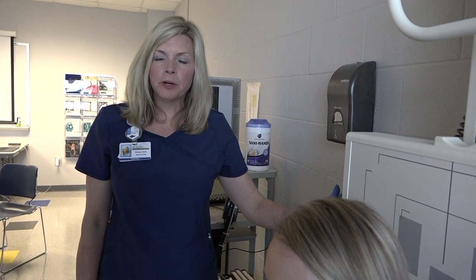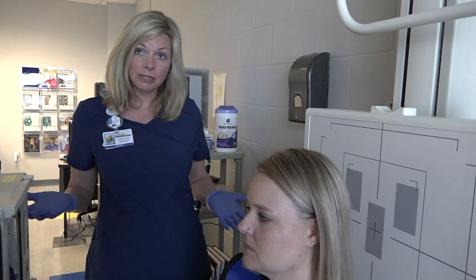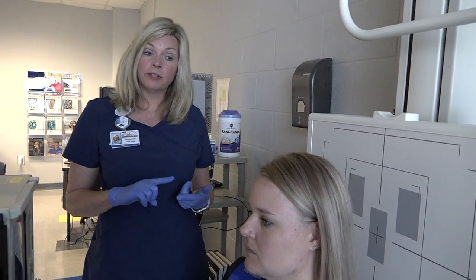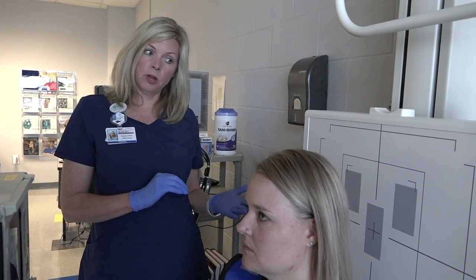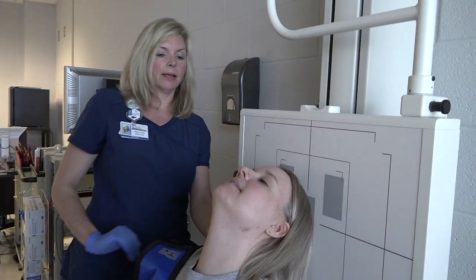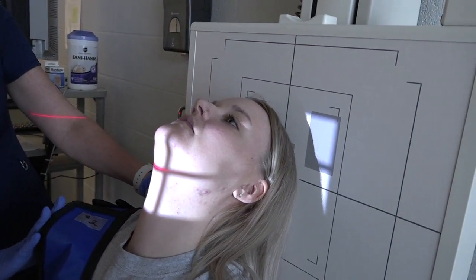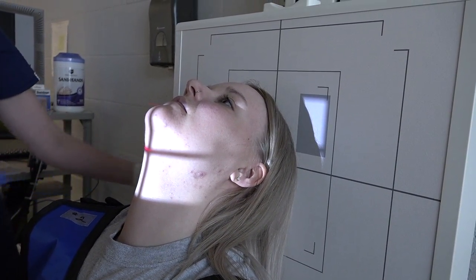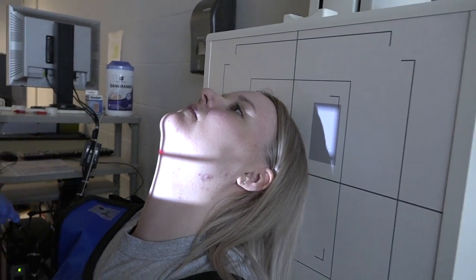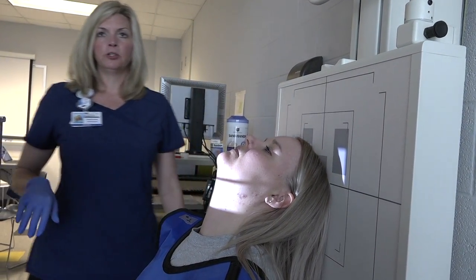Our next group of facial bone projections is our zygomatic arches. The first one is the SMV, then the tangential, and then the AP Axial. For the SMV — which doesn't change for the skull, sinuses, or facial bones — the patient extends their head back so the IOML is parallel to the image receptor. The central ray is an inch and a half below the mandibular symphysis, down the mid-sagittal plane, with no rotation or tilt.